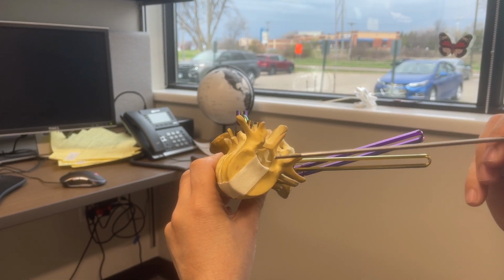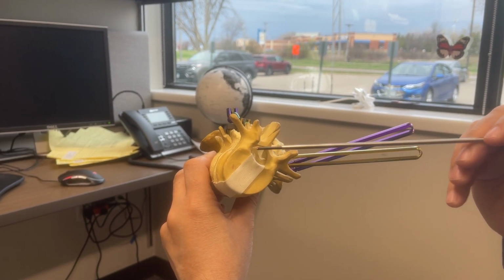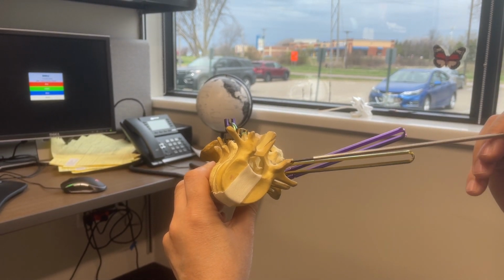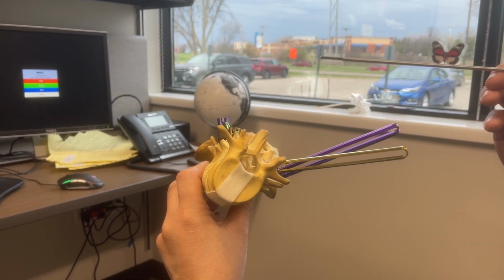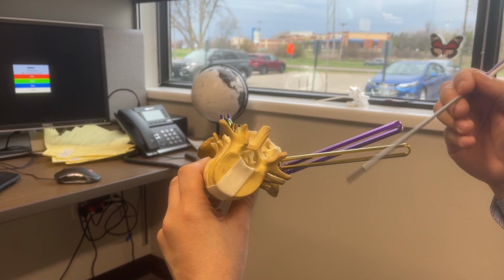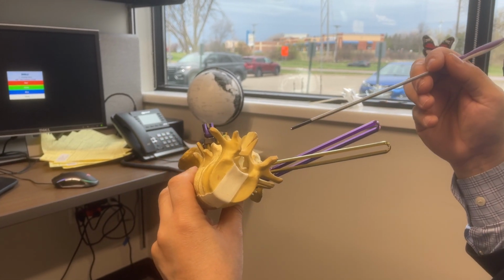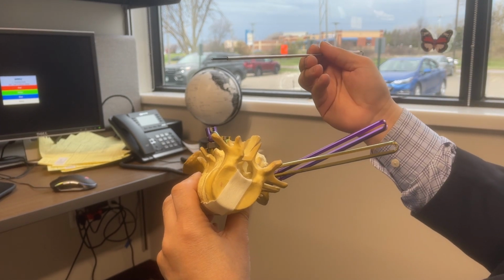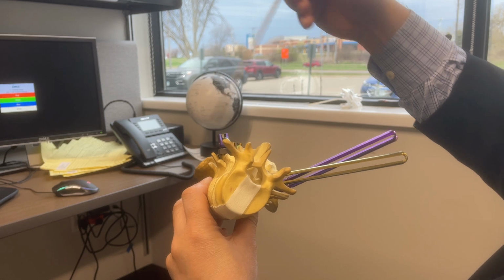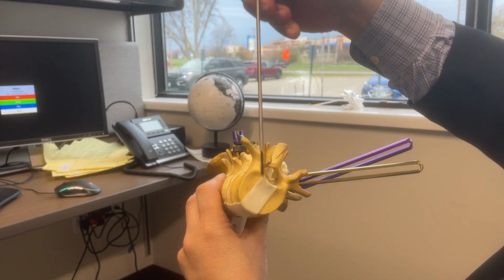Obviously, this is not one of your initial cases. As a matter of fact, rotation of the vertebral body of more than even 10 degrees, we are talking about a level 4 or level 5 soft transition, meaning you have to have a good number of cases under your belt. You have to be feeling very comfortable with the approach, trajectory, and the instrumentation before you try the rotation.